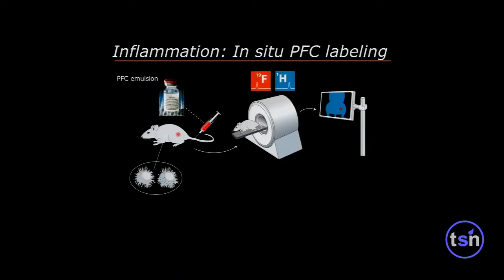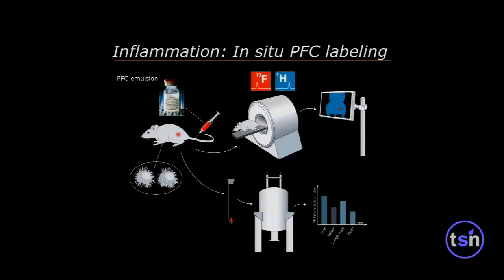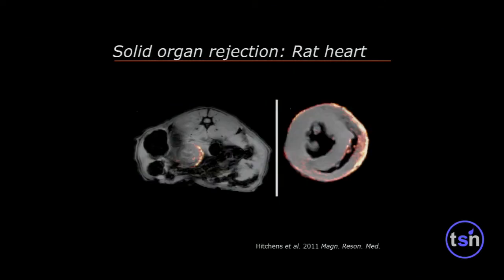Now, I'm going to quickly touch on another way that we've been doing imaging using perfluorocarbons that are formulated for direct intravenous injection. These are taken up by monocytes and macrophages in the body, thereby labeling the cells. They participate in inflammatory events and result in accumulation of fluorine at the inflammatory hotspot. And then you can detect that using fluorine-19. You can also detect it using NMR.